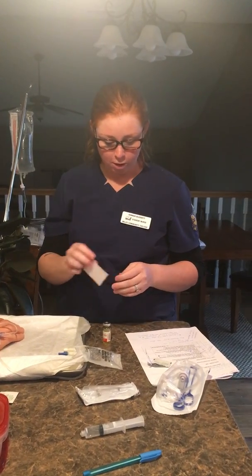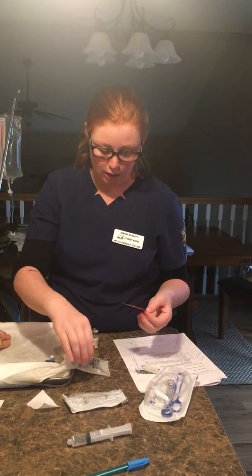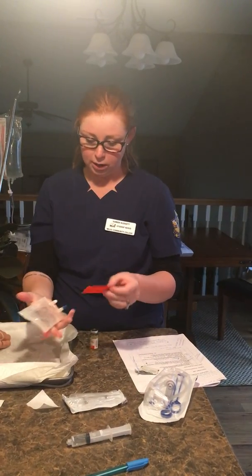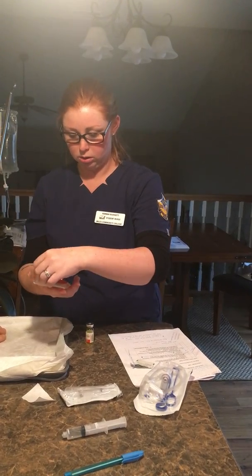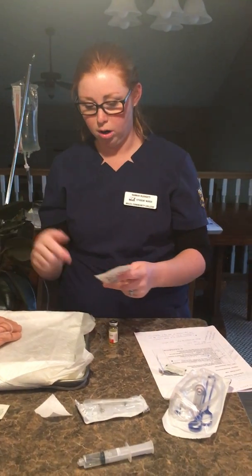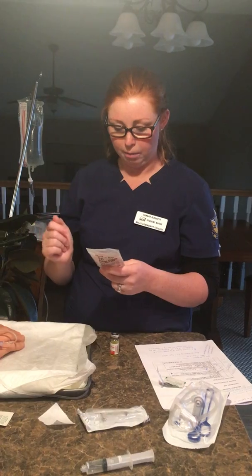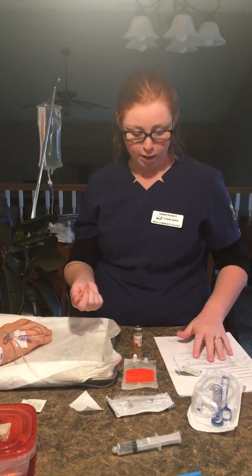Before we get any further, I'm going to go ahead and label this bag. I want to make sure that it's right side up for when it's hanging. This label has the patient's name, room number, the drug that has been added to this, the amount of the drug that's been added, my name, the base solution, as well as the date, the time, the start time, and our flow rate is going to be on there as well.